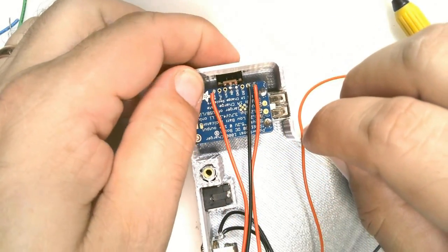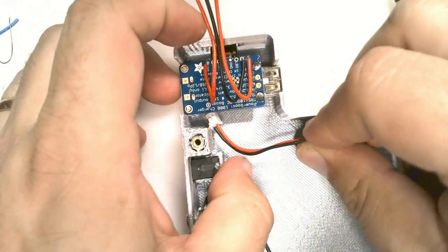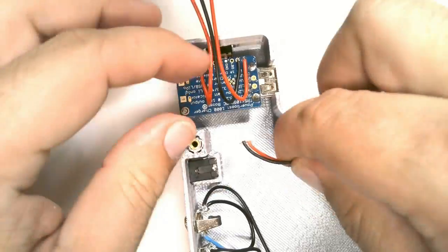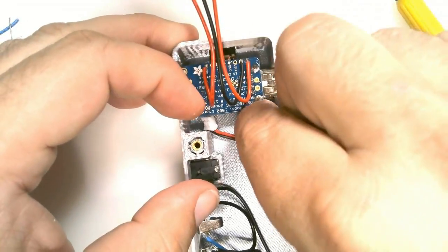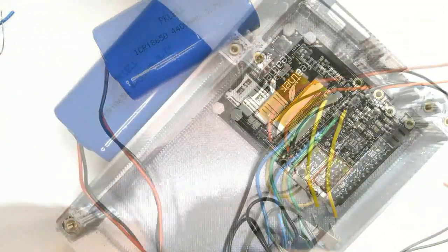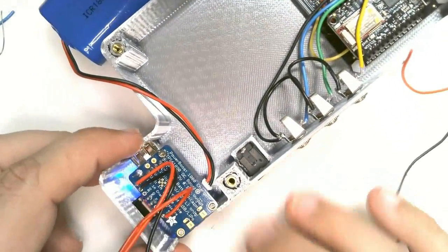Verify that the slide switch works properly. Oops, I made a mistake. We should have connected the battery to the power boost first. We had to take the board back out, connect the battery, and put it back in place.